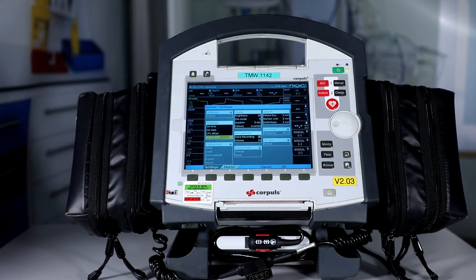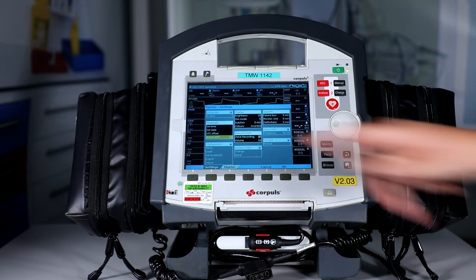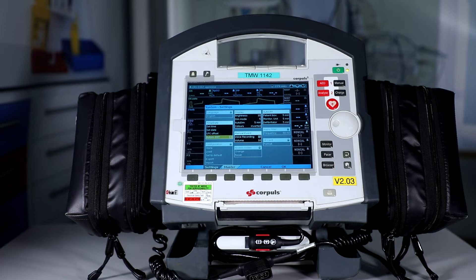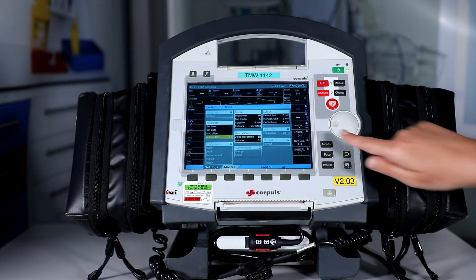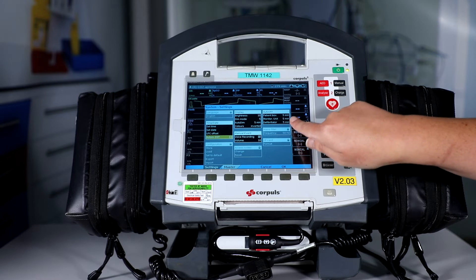Moving on to the manual event settings, ensure that voice recording is checked and the volume is set at 10. Check the auto-off group field — confirm that all modules are set to five minutes.